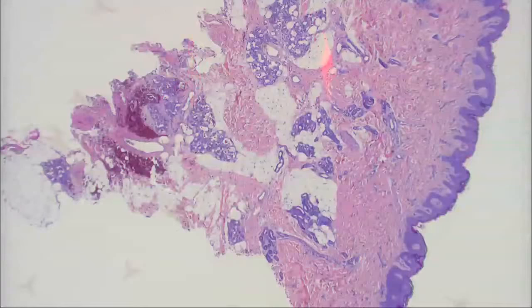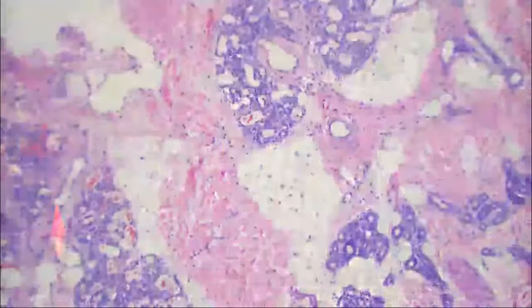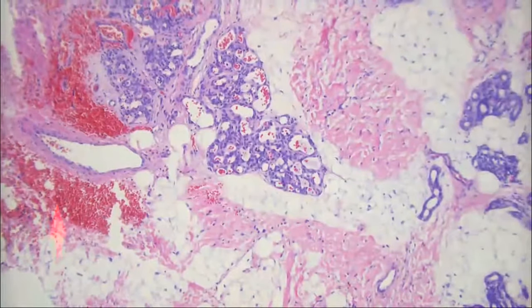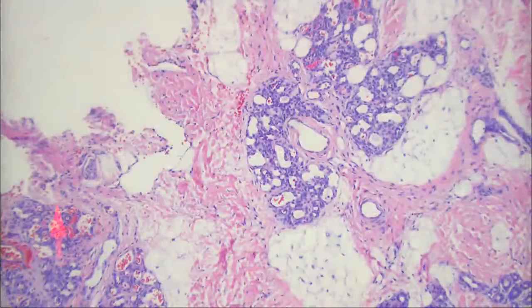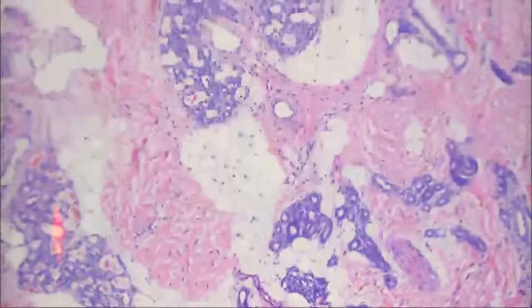It's fairly deep, down in the subcutaneous fat. So it's even theoretically possible it could be the surface of a vascular malformation, but it's definitely in the family of the hemangioma, vascular malformation spectrum, if you will. Histologically, it looks very, very similar. But in the glomeruloid hemangioma, you would see those glomeruloid structures, but you don't really need to see any other complication of POEMS. Exactly. Most of the time, you do see some of that.